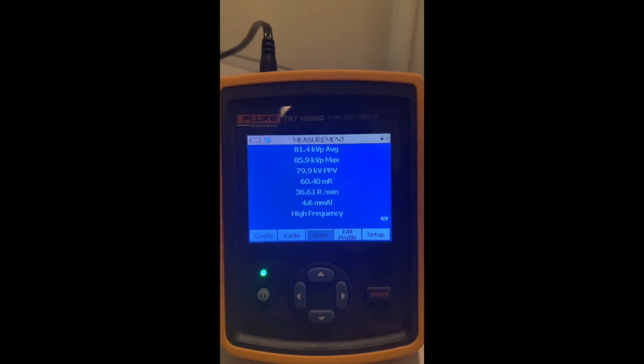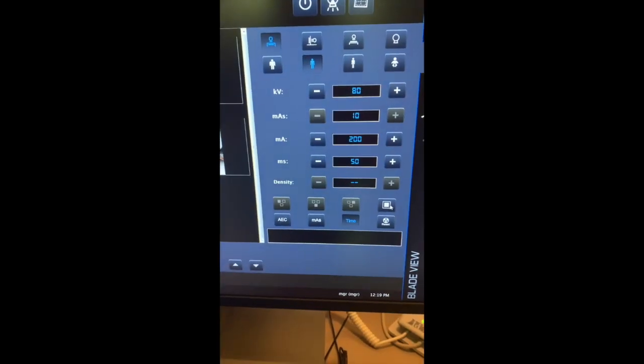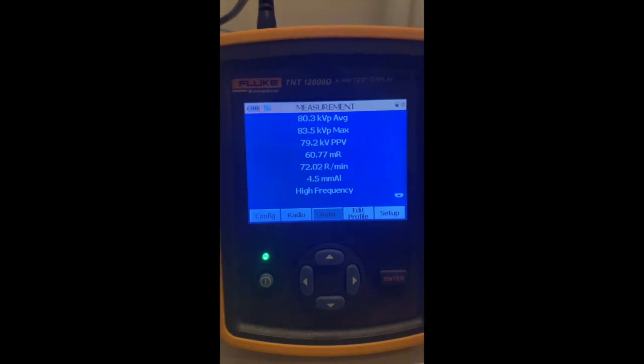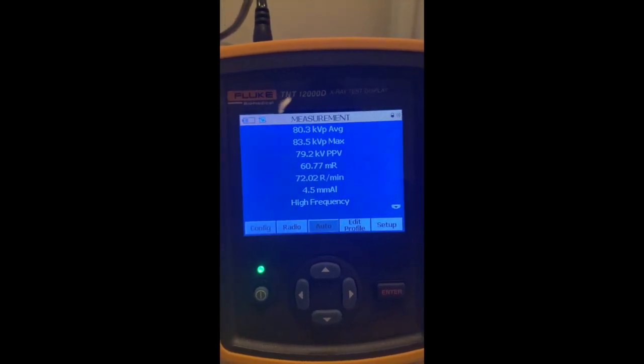We're gonna go ahead and do whatever one's adjacent to it. So, here we go. Sorry, I've said that way too many times. That's the phrase of the day. Let's do this. This time we're doing the same thing, just a 200 mA station instead. mR readout is 60.77.